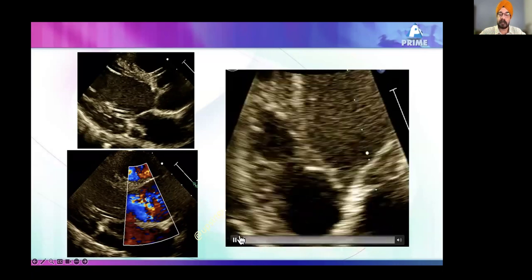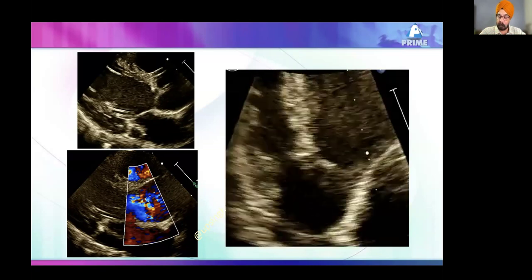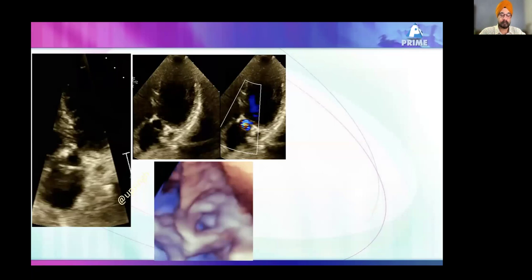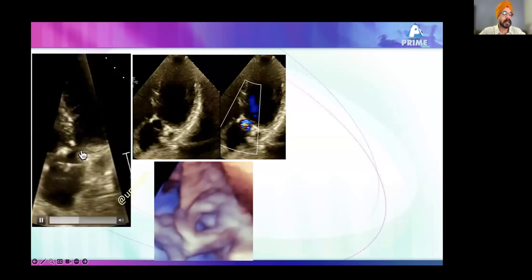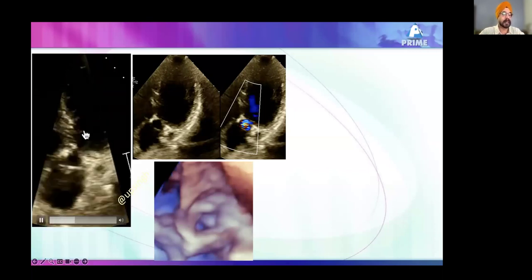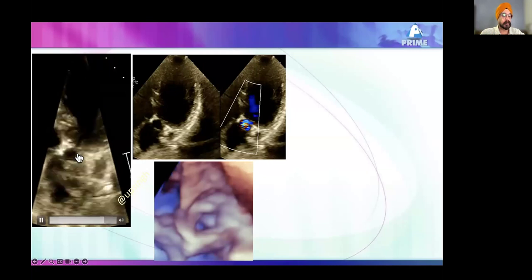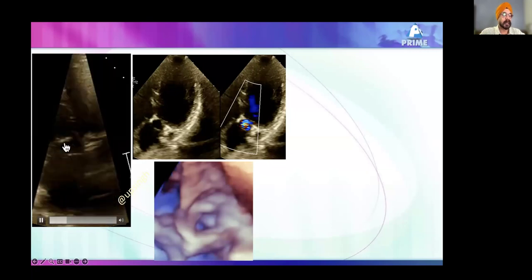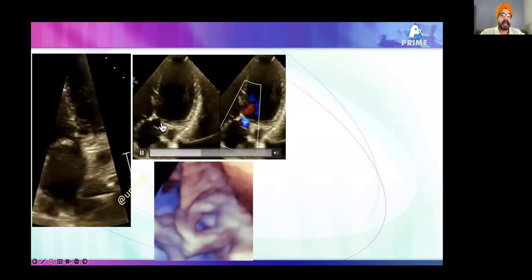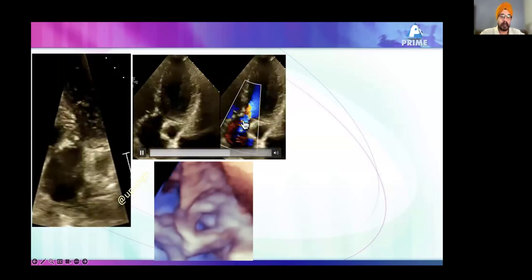When the valve opens, that is the time you happen to see this subaortic membrane, which would not open in systole. So I'm going to show you this subaortic problem last case where this is not a membrane, this is a little thickened muscular septum, and this is not hypertrophic cardiomyopathy because it is happening just before the aortic valve, and the rest of the left ventricular myocardium was fine. And this is again a kind of an obstruction.